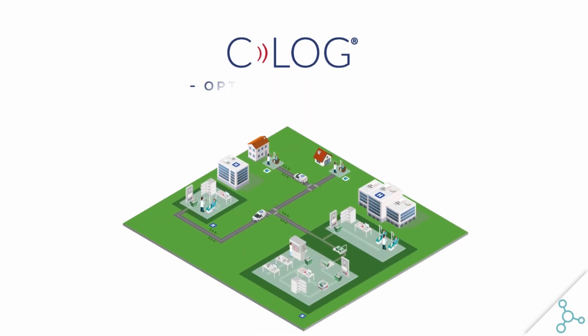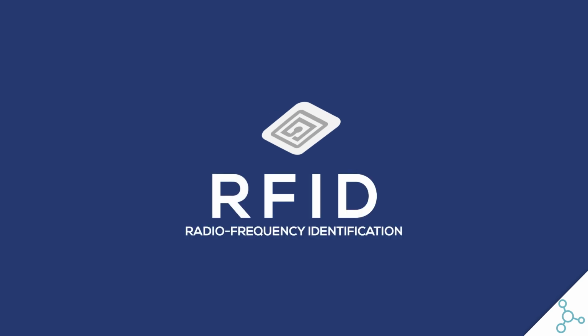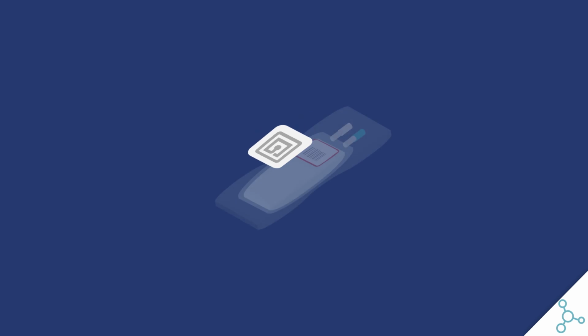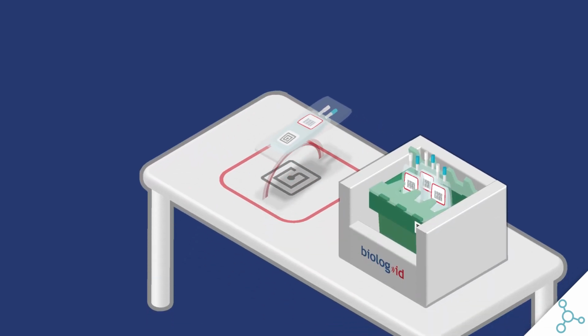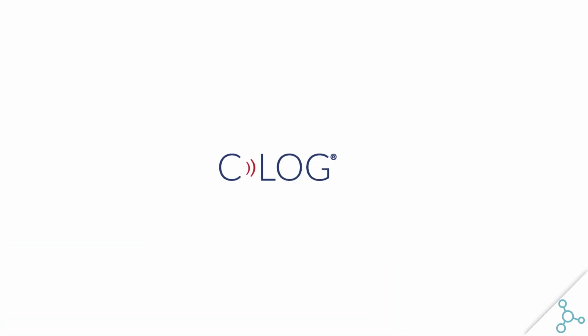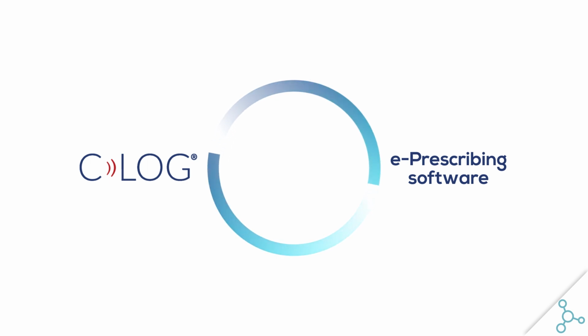C-Log is a solution that optimizes and secures chemotherapy treatments from the cytotoxic compounding unit all the way to the administration to the patient. The solution is based on RFID technology. Each preparation is fitted with an electronic tag with a memory chip. The data on this chip can be accessed and updated every time it is read by a dedicated reader. C-Log is interfaced with the chemotherapy manufacturing and prescription software, removing the need to record each step in the software. Data is exchanged in real time thanks to the RFID technology.